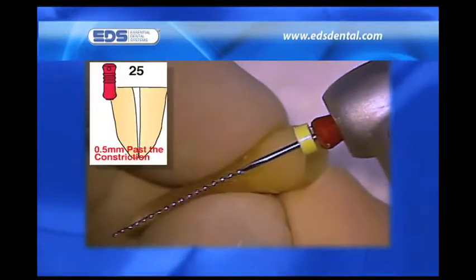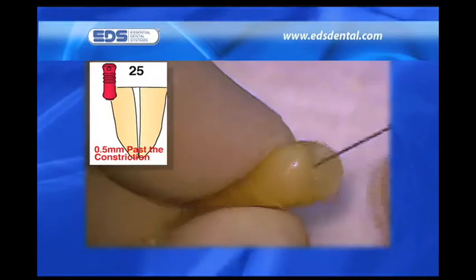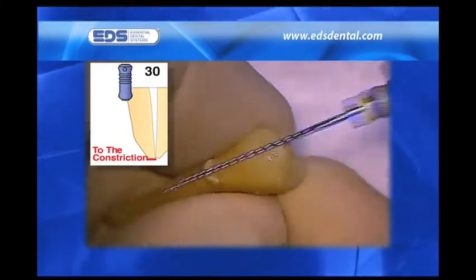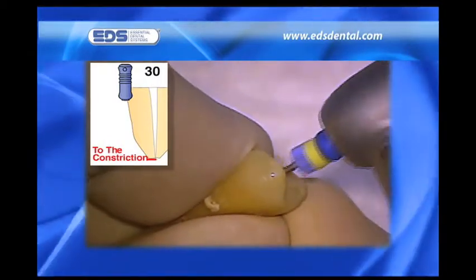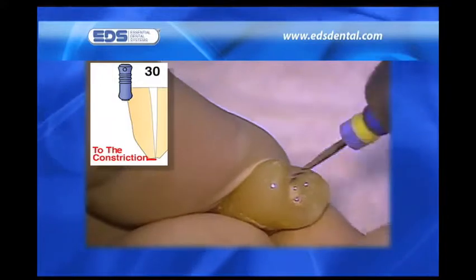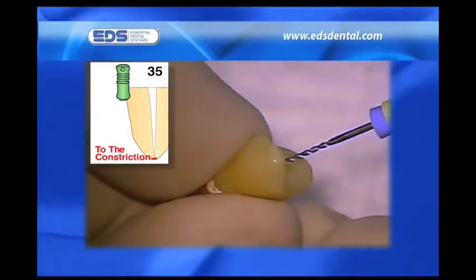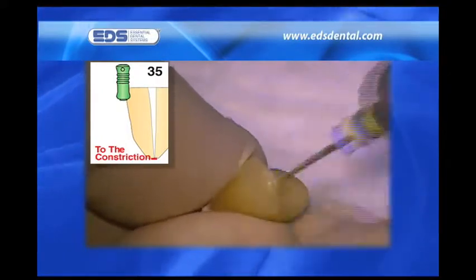With patency established, I take the number 25 SafeSider in the reciprocating handpiece to 0.5 millimeters beyond the constriction. Irrigants are being used continuously during this entire shaping procedure. Please again note how easily the relieved reamers negotiate to length. This is because they have half the number of flutes of a K-file, and the orientation of their flutes is twice as vertical, making them far better at removing dentin when a watch-winding or engine-driven reciprocating motion is used. Less engagement, superior cutting, and greater flexibility leads to not only easier apical negotiation, but a far superior tactile sense of what the tip of the instrument is encountering.